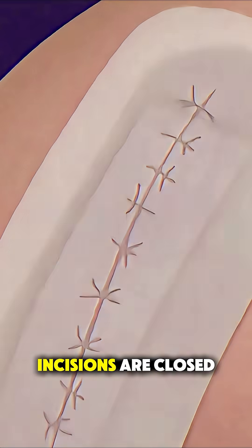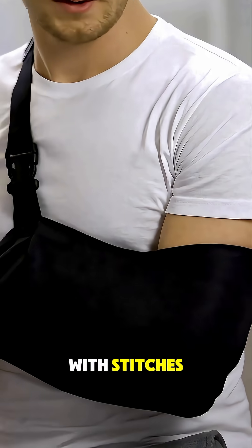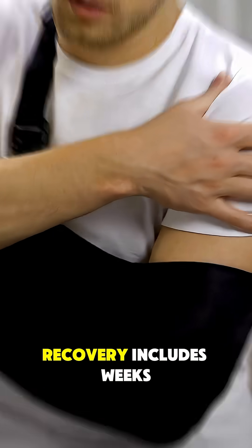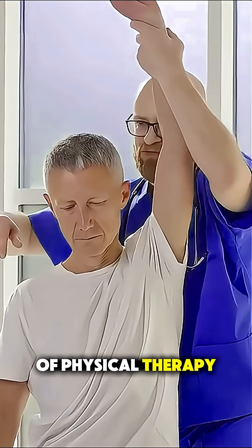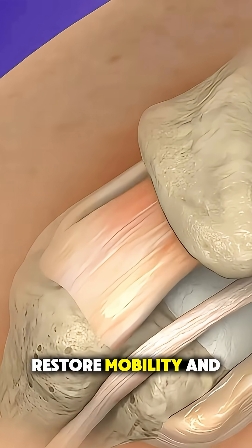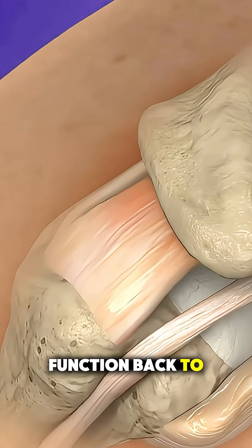Once secured, the incisions are closed with stitches, and the arm is placed in a sling to begin healing. Recovery includes weeks of physical therapy, but this procedure can significantly reduce pain, restore mobility, and bring your shoulder function back to life.